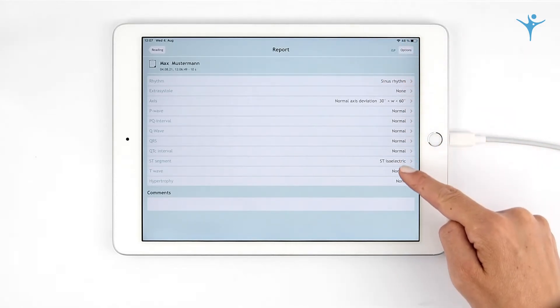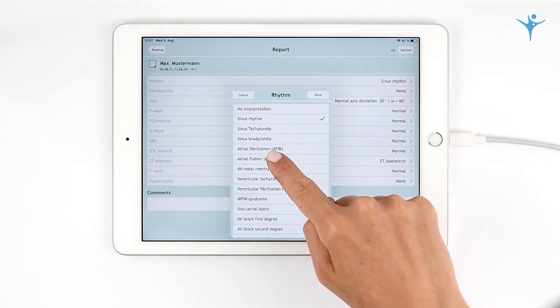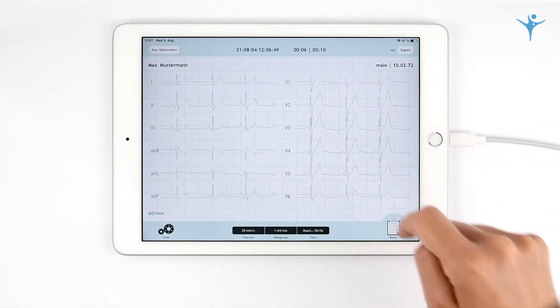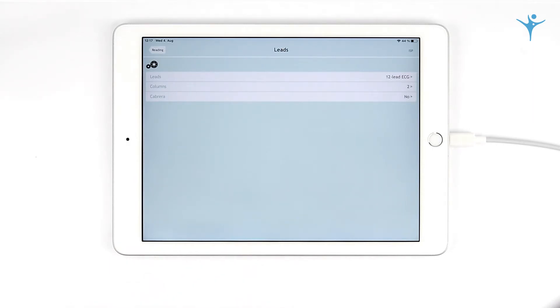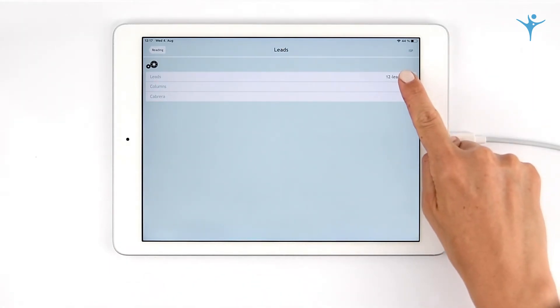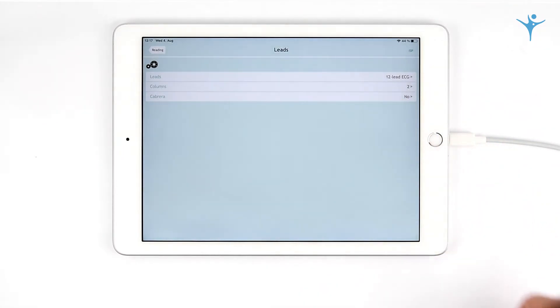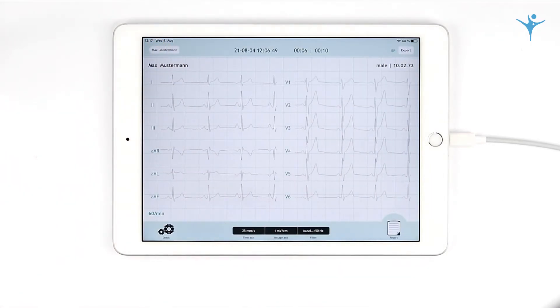In case of a pathological ECG, you may set the respective parameters. CardiSecure Pro offers you standard ECG settings, such as leads — simply select your preferred leads and display format — as well as speed, voltage, and filters.